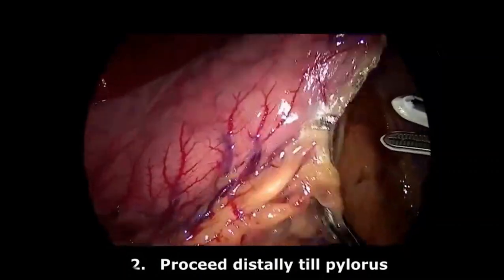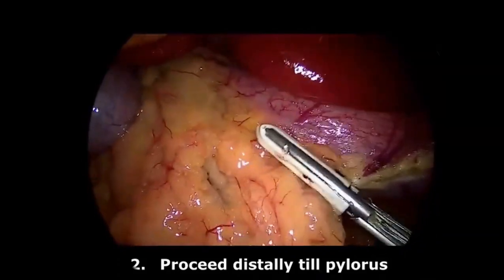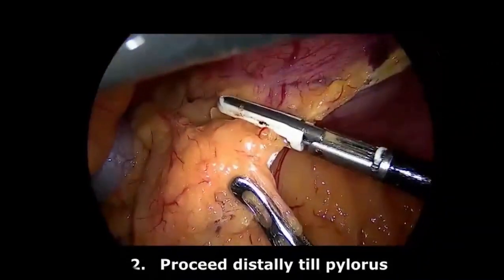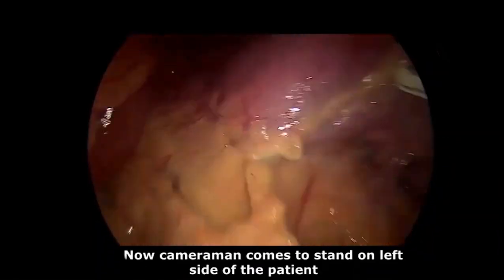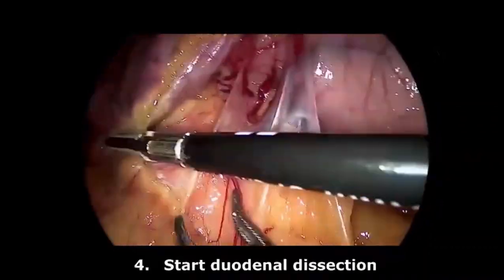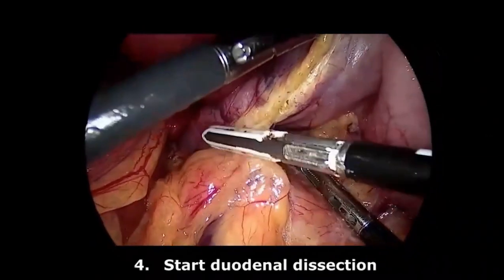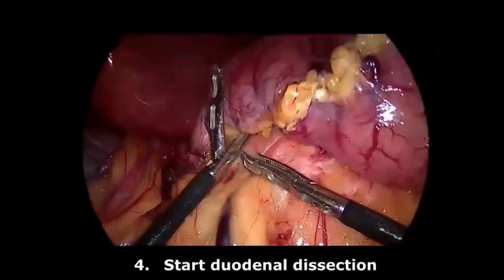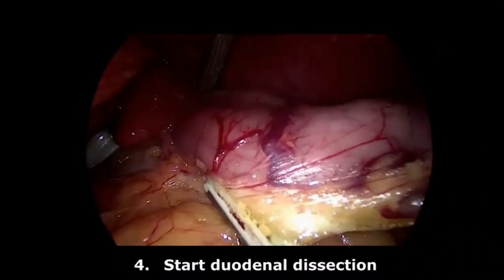This is another case. I proceed distally till the pylorus in the ordinary dissection of the sleeve gastrectomy operation. I look from above to appreciate where the pylorus is. Then I continue the dissection, proceeding distally till the pylorus. When I reach the pylorus, I will find the pancreas attached to the posterior aspect of the first part of the duodenum. I continue my lateral dissection along the greater curvature of the stomach and the duodenum.